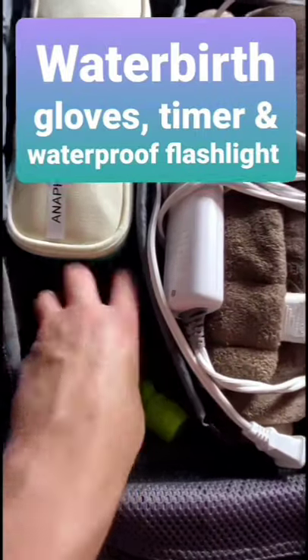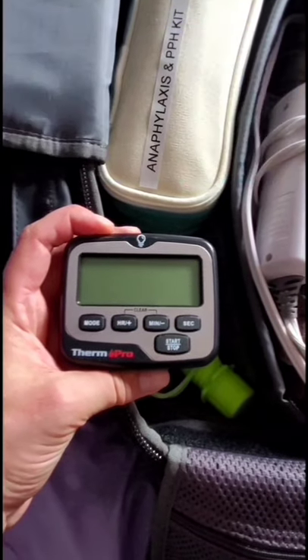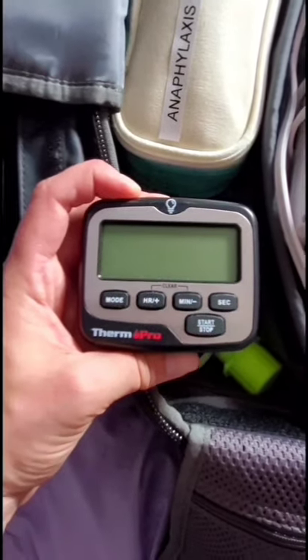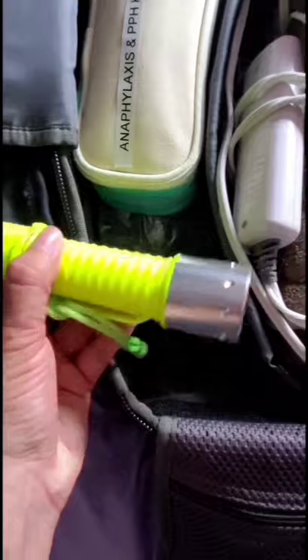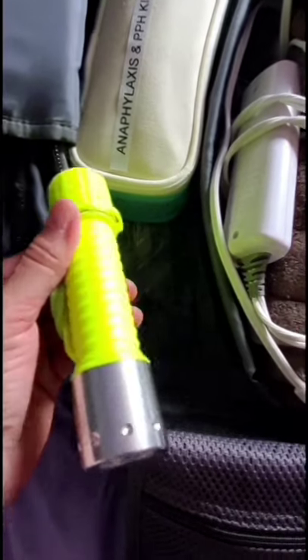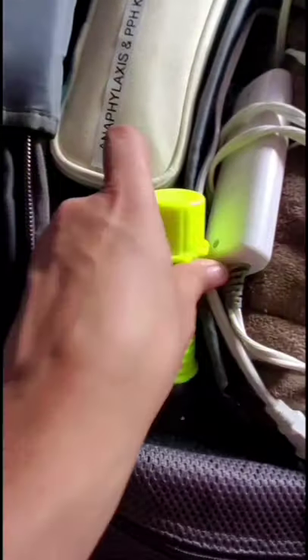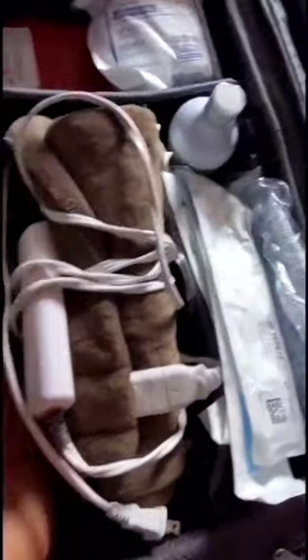Next to the saline I've got a bag of water birth gloves. I also have a little timer — I usually use my phone for time of birth, but if I'm getting lots of pages or it doesn't make sense, I carry this extra kitchen timer which works really well and is backlit so it's easy to see. I also now carry a waterproof flashlight, just out of fear of dropping my phone into a shower or birth pool.